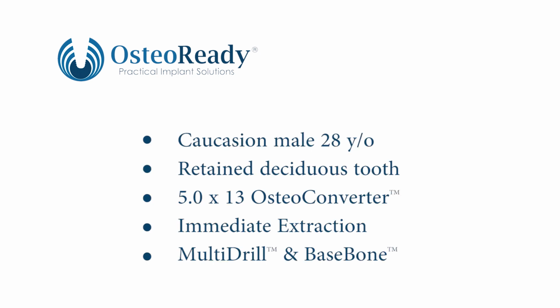Okay, I'm going to present a 28-year-old Caucasian male who has a retained deciduous tooth. I've planned an immediate extraction. I'm going to use the multi-drill and base bone from OsteoReady. And the implant I selected is a 5mm by 13mm osteoconverter implant.